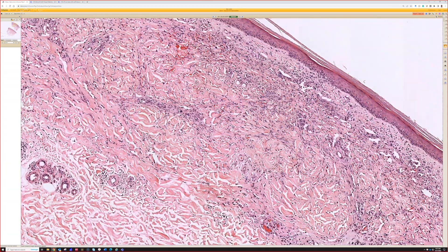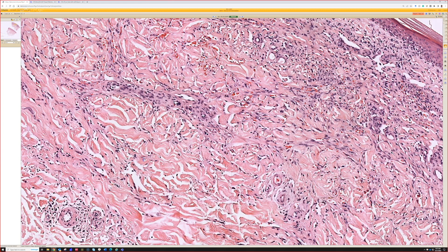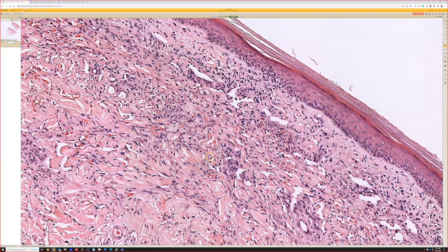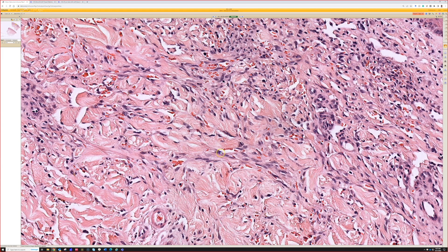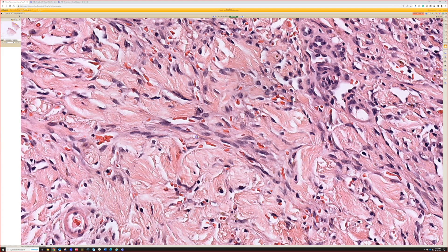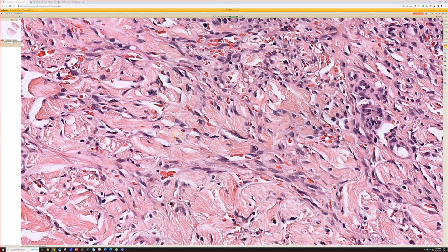One problem is that we always learn slit-like spaces and blood, but there's an issue here: there are slit- or cleft-like spaces between the collagen bundles that are just artifactual splits — a cracking artifact almost. What we're really looking for are the slit-like spaces that are lined by endothelial cells — little spaces in between spindle cells that are trickling out between the dermal collagen bundles, sometimes wrapping around them.